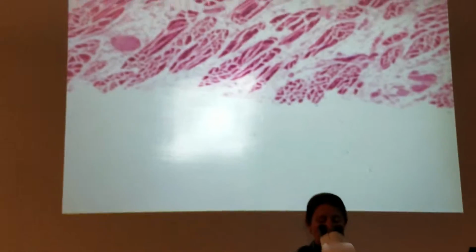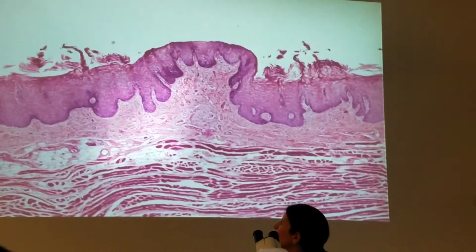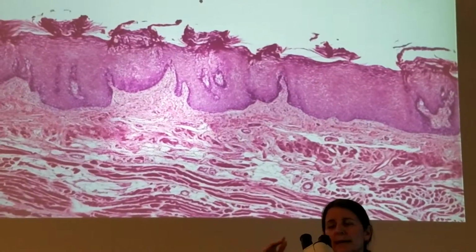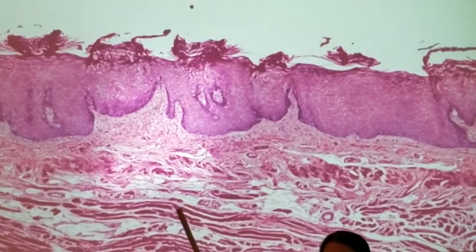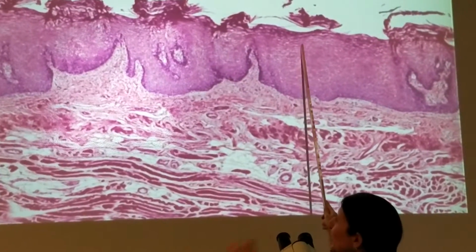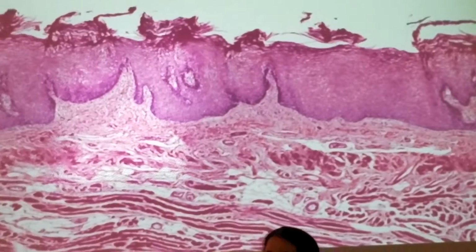We've got the filiform papilla, the stratified, all multiple choice. Okay, this is a good time to also introduce the layers again, because these are the same: epithelial layer followed by the lamina propria. It's always going to work that way. This layer right here, multiple layers, what would it be? Stratified squamous. Underneath stratified squamous is lamina propria.